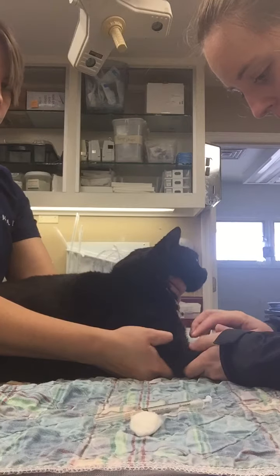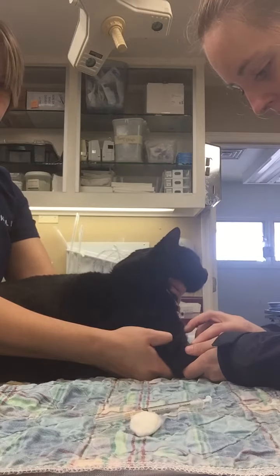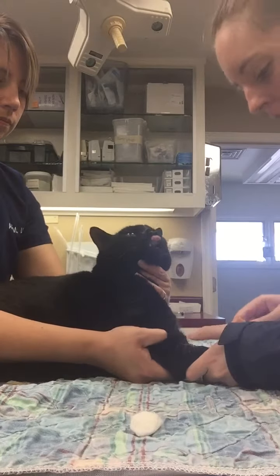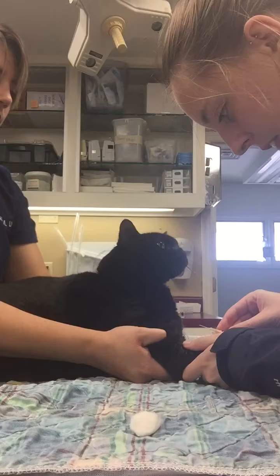Now I have located the vein. I'm going to insert the needle bevel up.